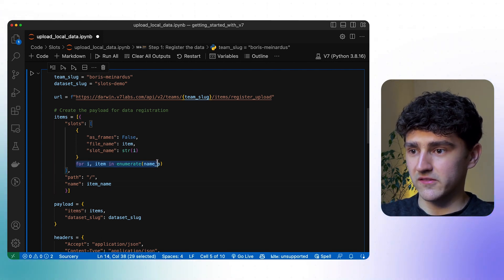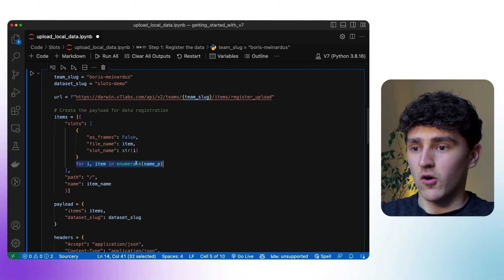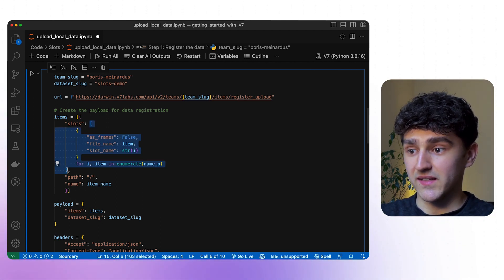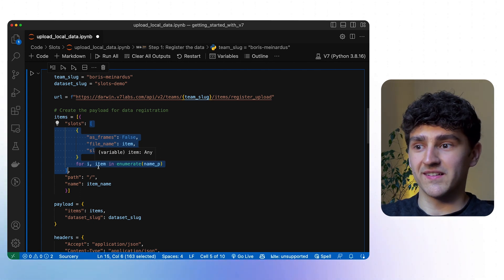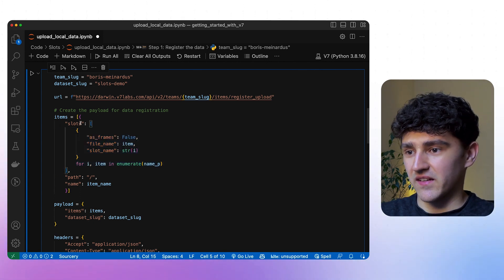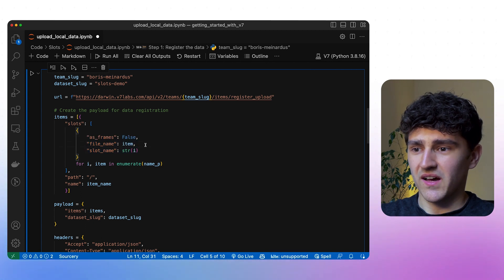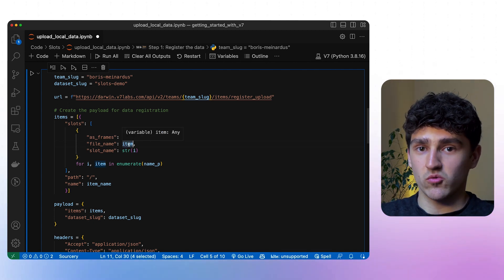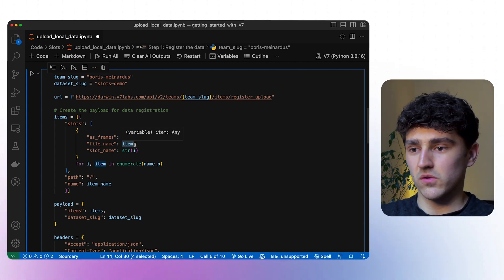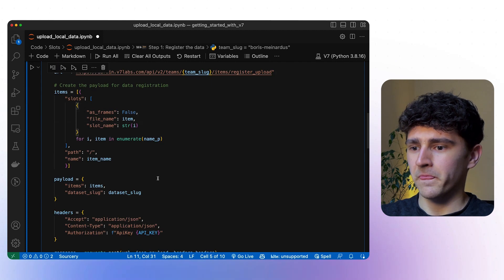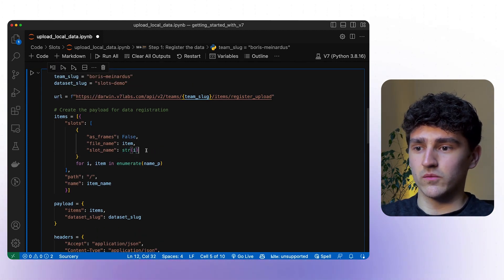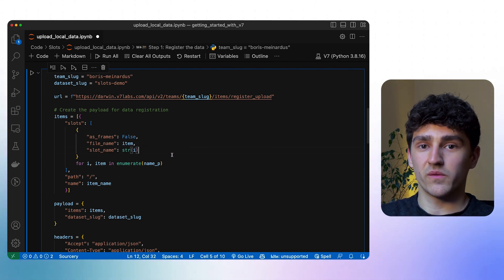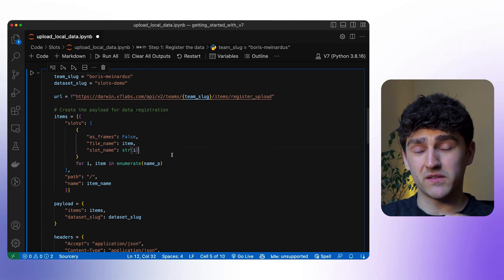Inside the list comprehension for all items, I iterate over the actual images going into the specific slots. I add a list of all slot items for one particular global item. The values we provide are almost the same as in the full-length video — we provide the file name of the file being uploaded. In this case, breast_right gets slot name zero and breast_left gets slot name one. That's how we associate individual images to specific slots of the whole item.